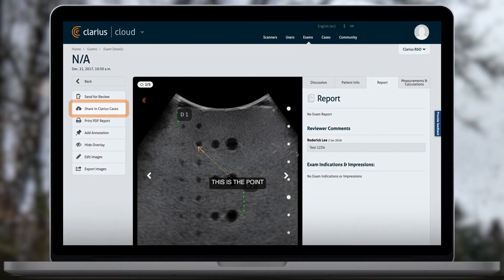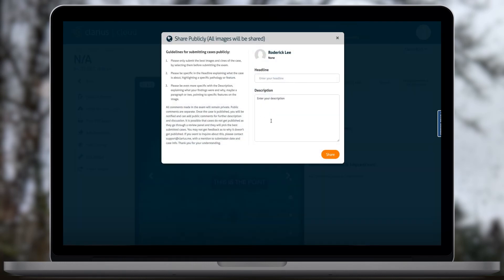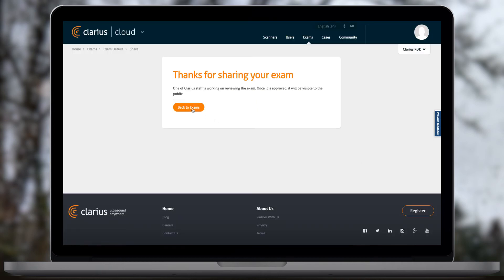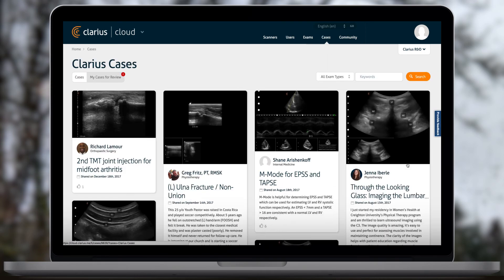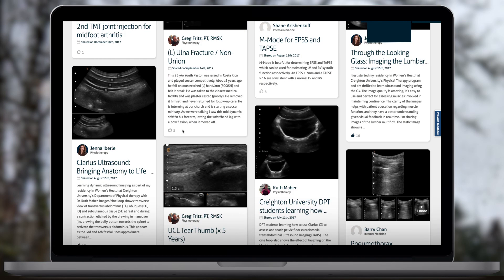Social and Sharing Features. To submit an exam to Clarius Cases, select the images you would like to submit and click on Share in Clarius Cases. After your case has gone through our review process, it will be visible on the Cases page. Clarius Cloud enables you to interact and share findings with the broader ultrasound community. Clarius Cases are groups of images taken from an exam meant for sharing publicly, for education, discussion, and feedback. Patient information will not be included in Clarius Cases.